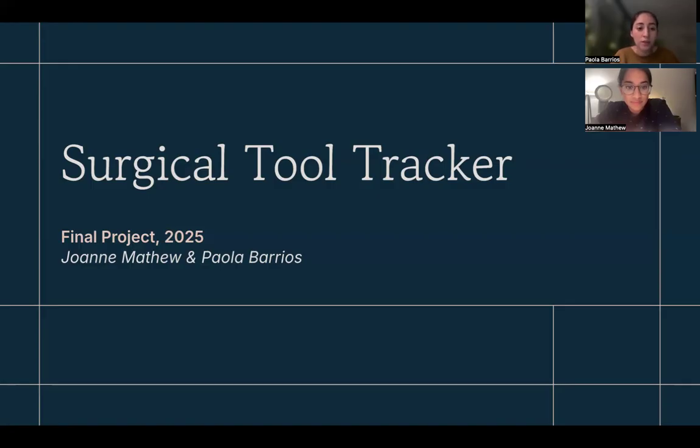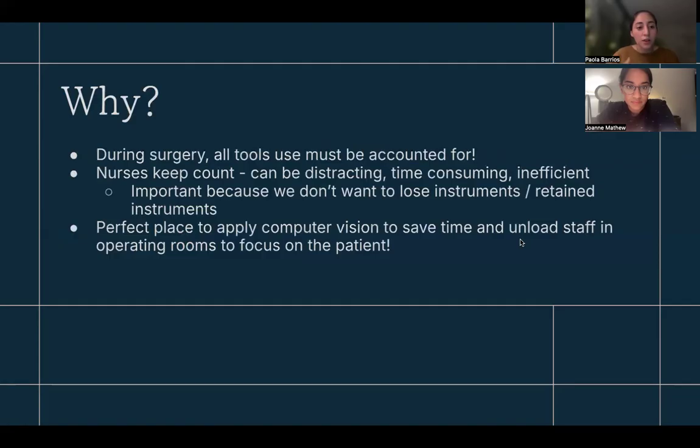And today we're going to be talking to you about our surgical instrument tool tracker. We're very excited to show you guys. We decided to do this project because we felt like it was a real problem that we could solve with our computer vision skills.